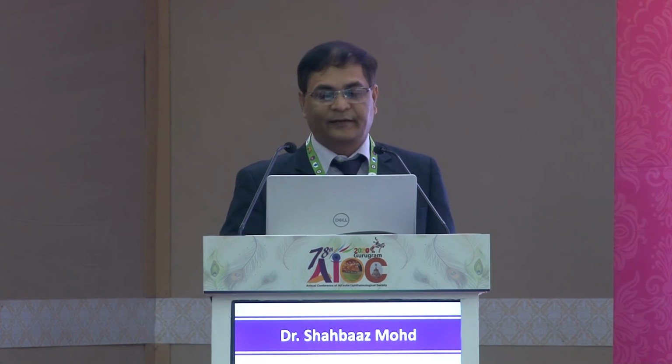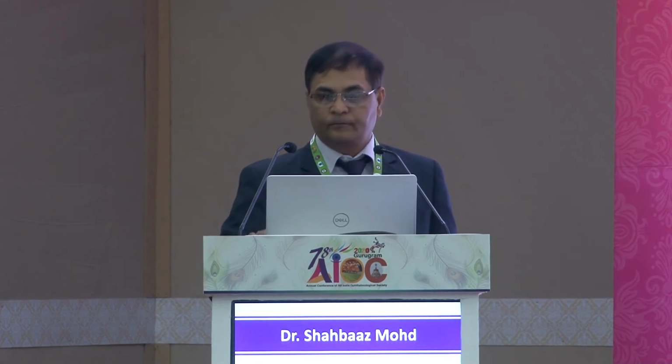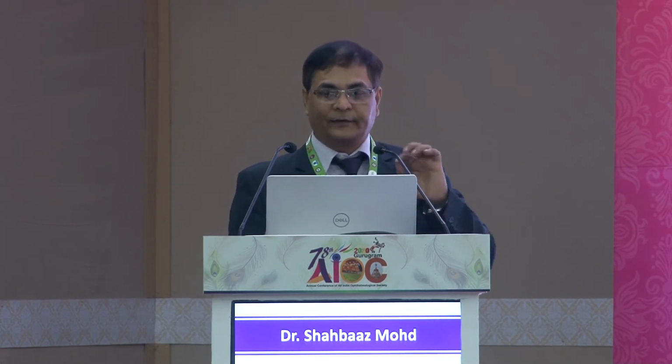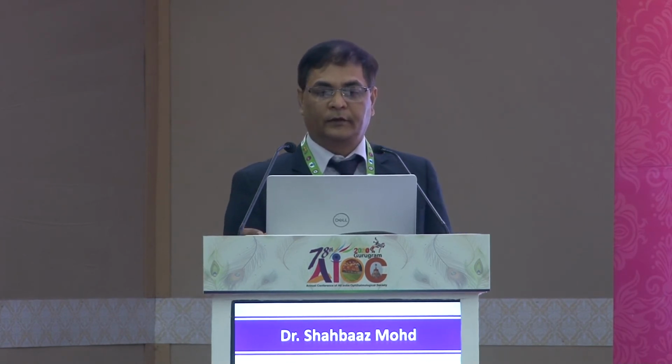So these are the various shells. Here you can see this is at a distance, from 2 to 8 millimeter from the cornea. The patient's head should be straight, and the patient should fixate straight towards the ceiling, or you can give a fixating target with the hand. After fixing the shell on the eye, just fill it with the fluid.